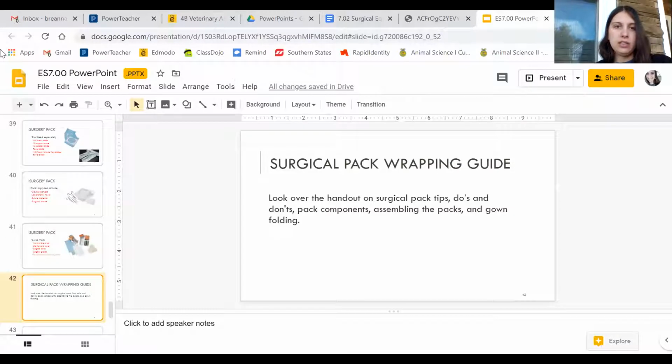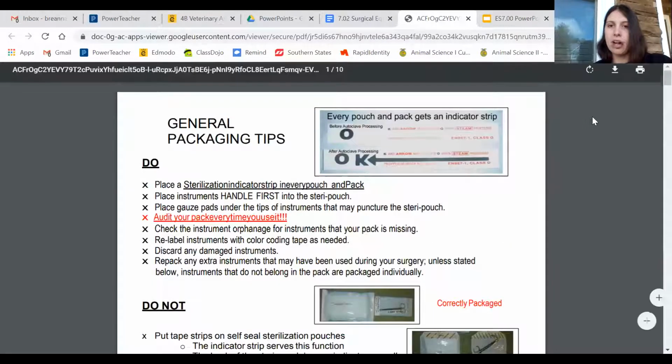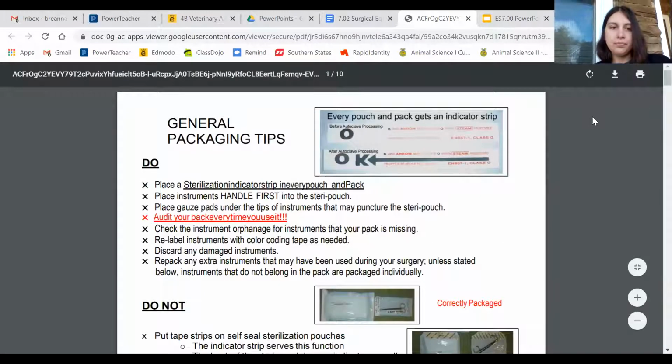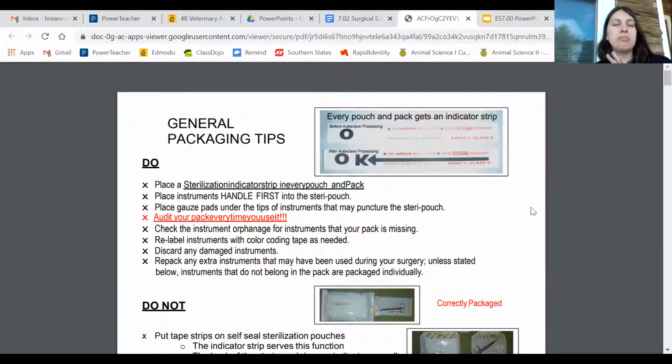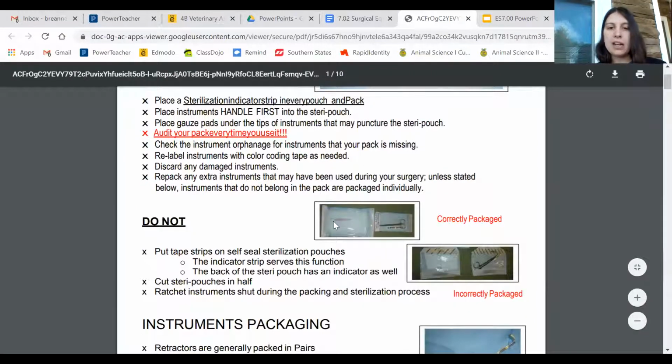Then I want you guys to look at this. It's kind of a lot of information on surgery packs and surgery wrapping. It contains the do's and the don'ts, and it has a lot of really helpful pictures.